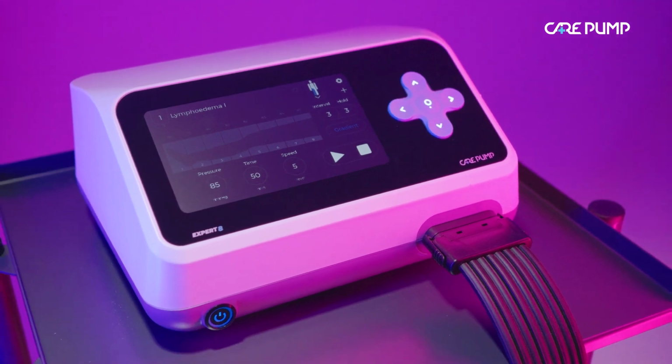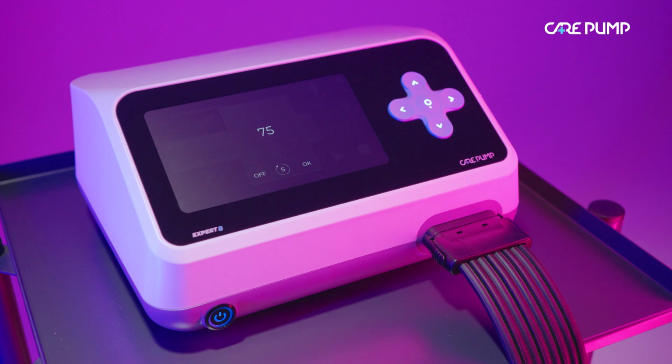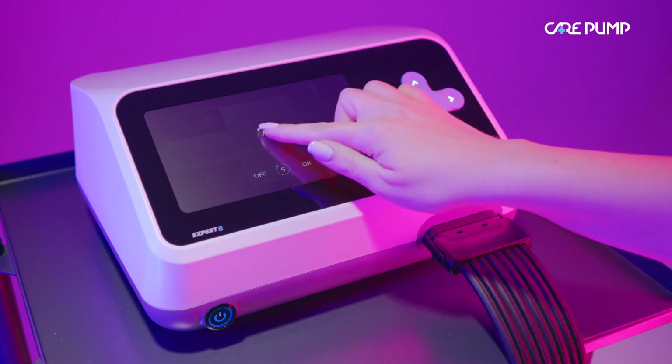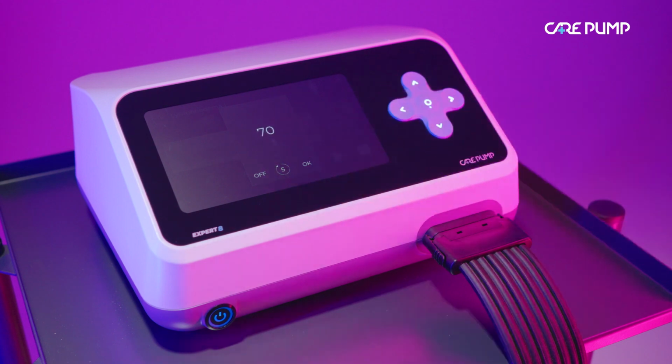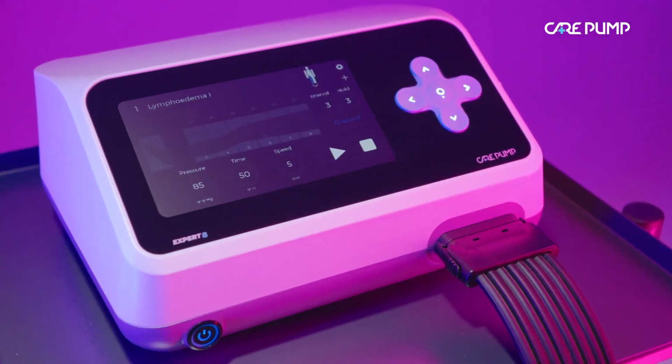To change the pressure for the selected chamber, touch the corresponding area and by moving the values on the list up and down, select the appropriate value. It cannot be higher than the pressure in the previous chamber. To turn off the chamber, press Off. The switched off chamber will not be highlighted.